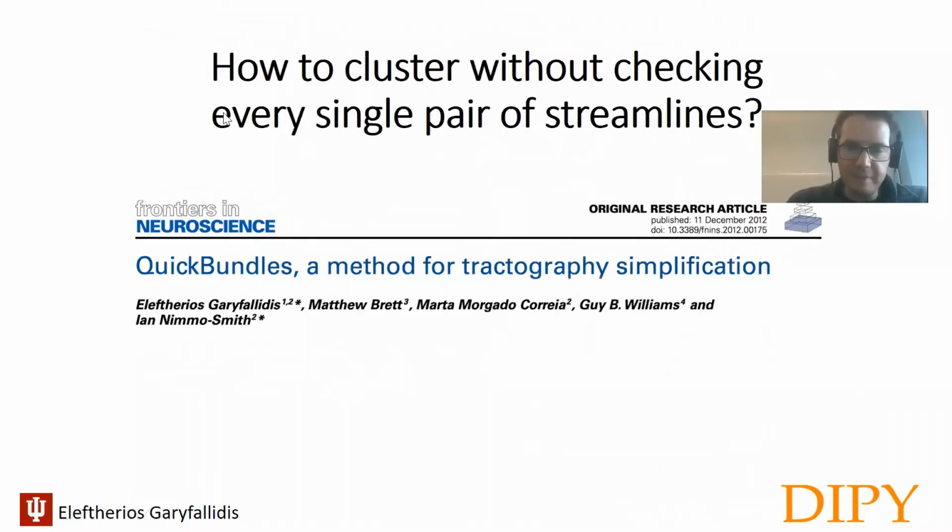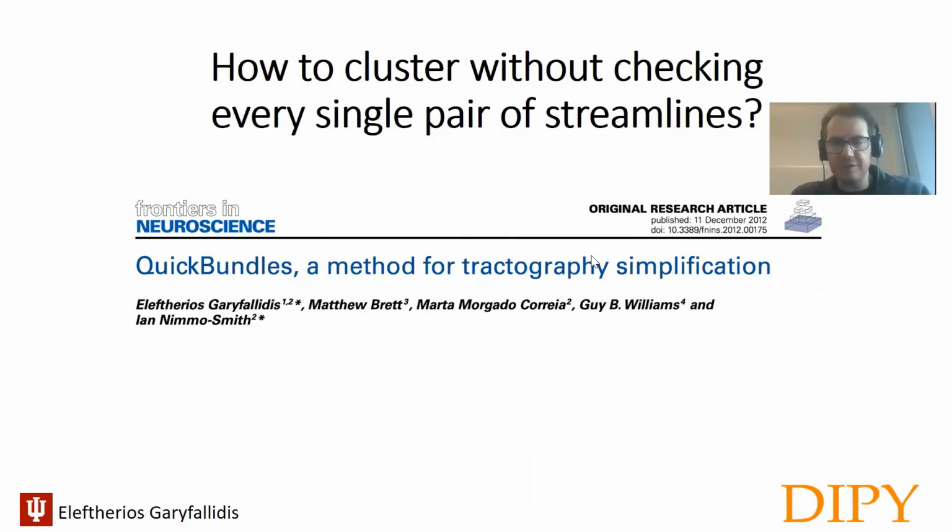So this is the paper that used QuickBundles, a method for tractography simplification, that used this idea of an MDF distance for the purposes of clustering.